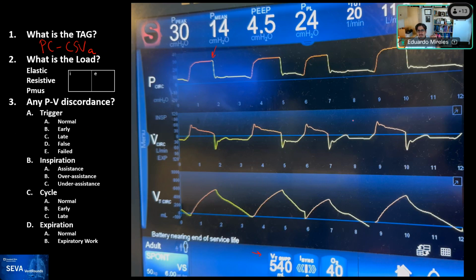So probably the proof is in the pudding, and Samit can tell us if they went down on the tidal volume and this actually corrected and the patient started breathing better, or if they treated the auto PEEP and the patient got better. Those are the two pathways here, Samit. So why don't you guide us a little bit here?